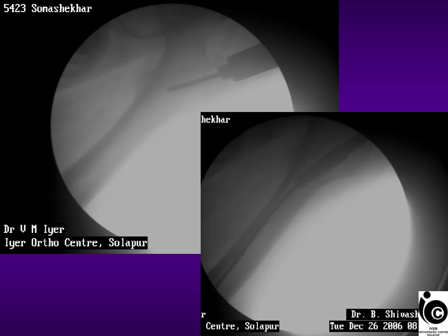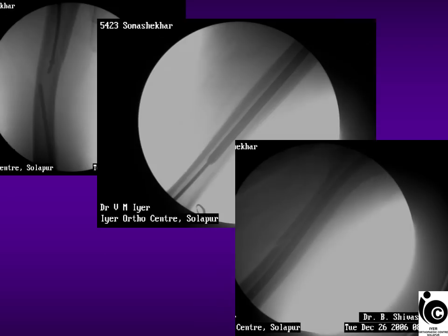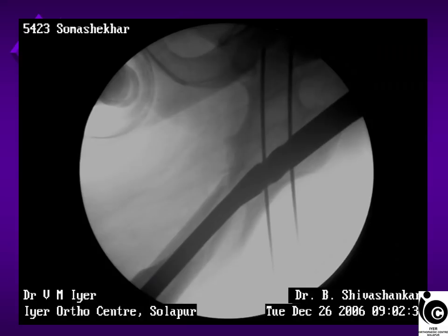You hardly can see the fracture in this reaming guide wire picture. Reaming has been done to our satisfaction. You can see that the reamer is bent here. Fortunately, the reamer can bend, but the nail cannot bend. And when we inserted the nail, there was a huge butterfly fragment because the nail hit the medial cortex, causing this iatrogenic fracture. This is my own case.